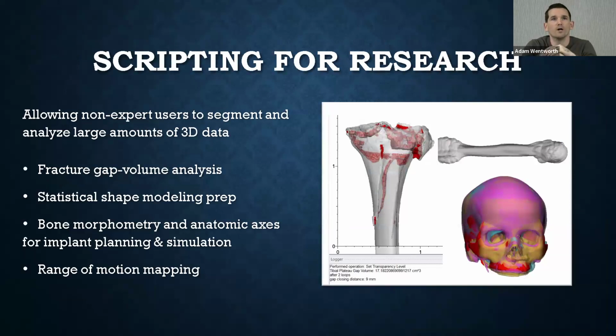And lastly, I wanted to highlight some of the scripting for research, which I've done more recently. And I think one aspect of scripting is enabling non-expert users to process large amounts of the 3D data. We have the benefit of residents coming to our lab and really wanting to utilize 3D data to prove out their hypotheses for certain aspects. Knowing that 3D is better than 2D for planning in a lot of circumstances.